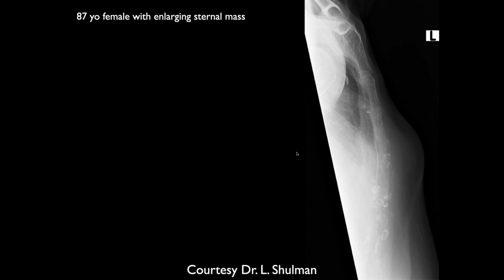And that never took off very well, I think in large part because we just didn't have sophisticated enough techniques to really be able to evaluate the spectroscopy images. And I think as we go forward, people may well develop more robust algorithms that can do that. And so maybe eventually we'll be able to do that non-invasive biopsy by MR, but we're certainly nowhere close to being there right now.